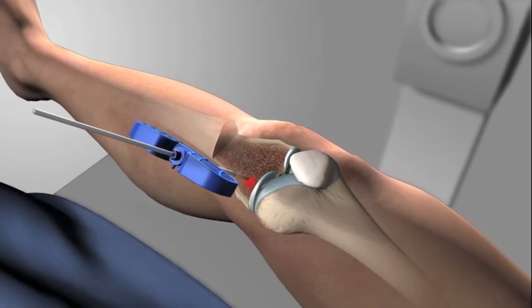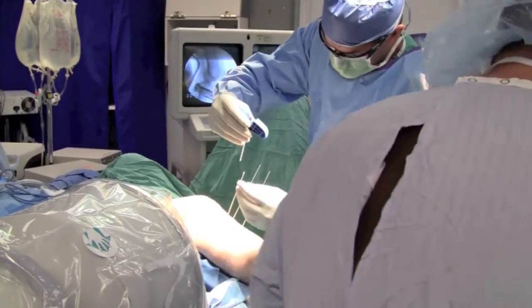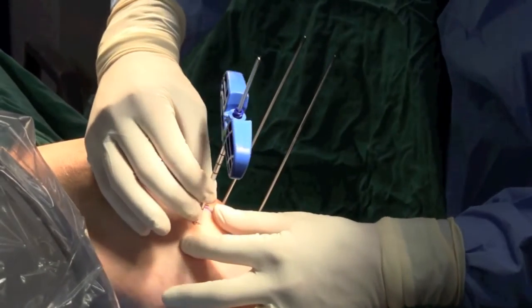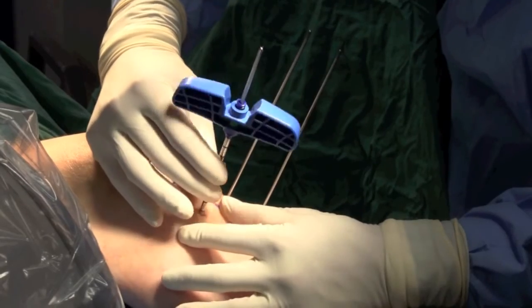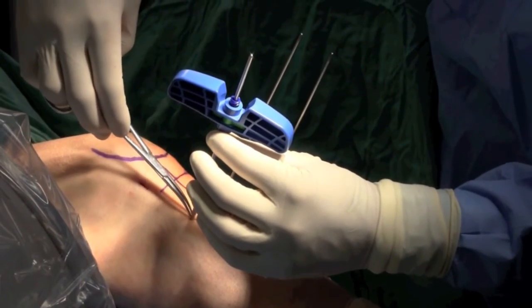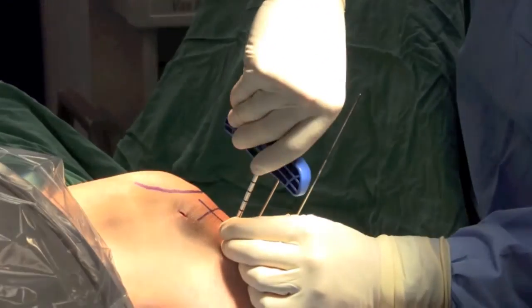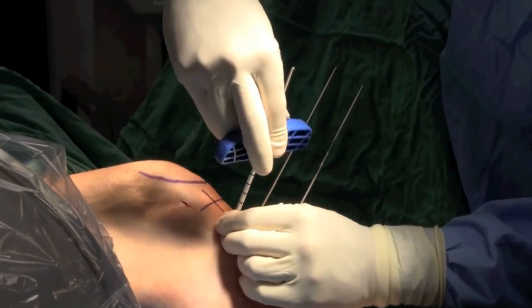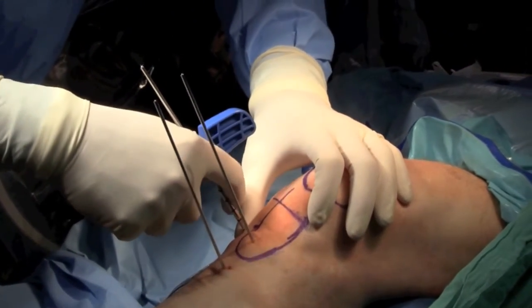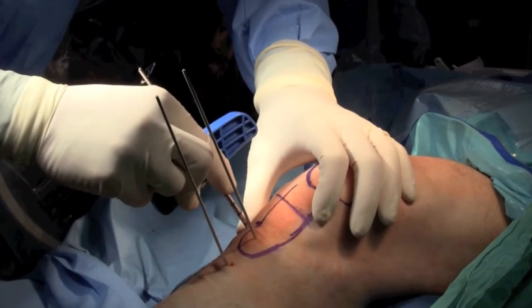Once our trocar is in place, we remove the jig and insert a cannula directly into the site of the bone marrow edema. In the live surgery video, the trocar is placed under direct fluoroscopic or x-ray guidance, and the cannula is inserted into the bone of the tibia, targeting the site of bone marrow edema — in this case the patient with the stress fracture, so we're targeting that fracture of the tibial plateau. X-ray is used several times to confirm the appropriate depth and location prior to injecting the cement.